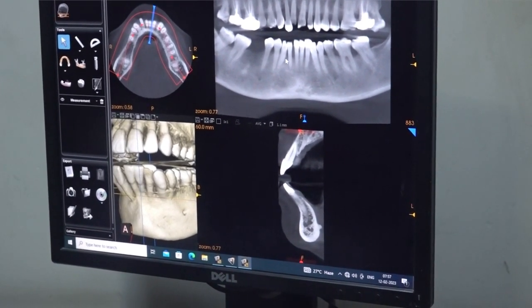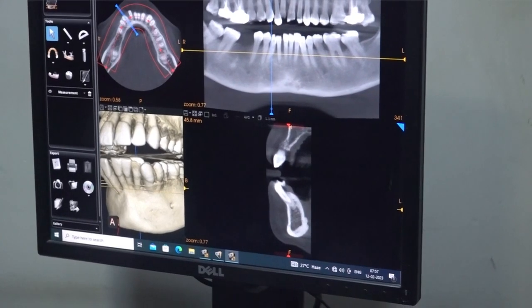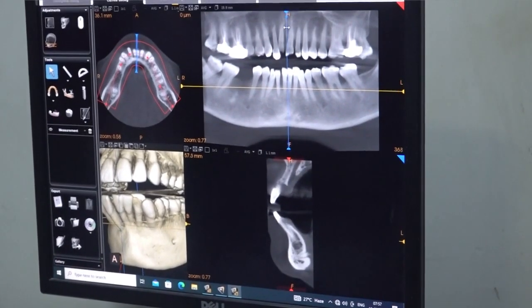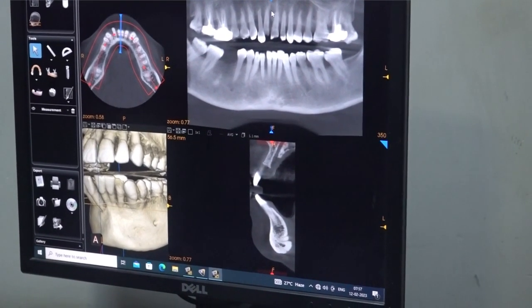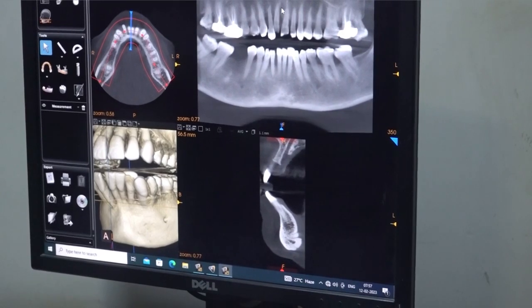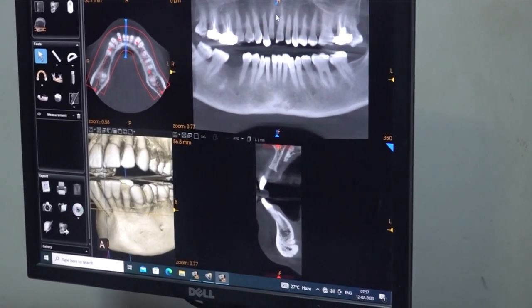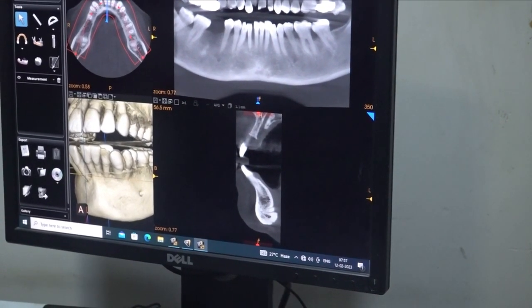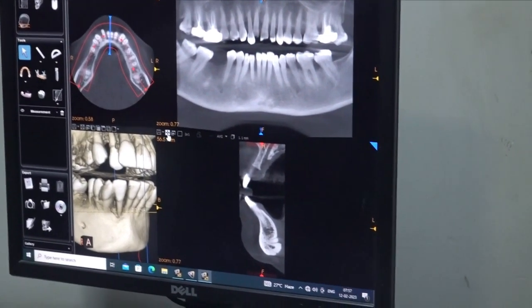Place one implant in each canine area — do not worry about the socket angulation, place them straight. Place 2 more implants next to the midline with a safe distance between all 4 implants. The challenge is to maintain safe inter-implant distance. If implants are too close to each other, the patient may have constant pain because the bone between them is very thin and may develop necrosis.